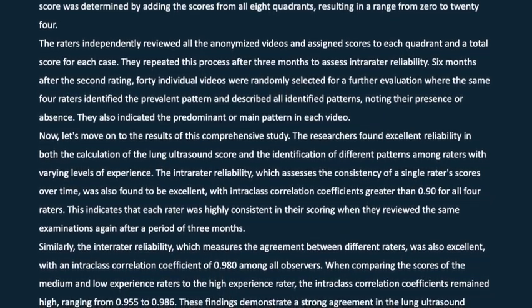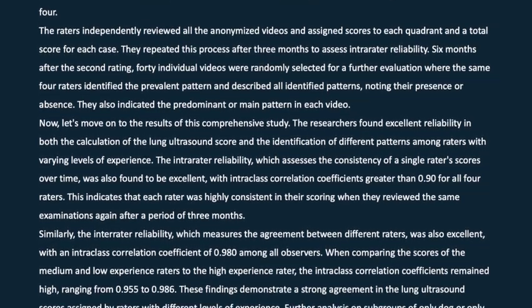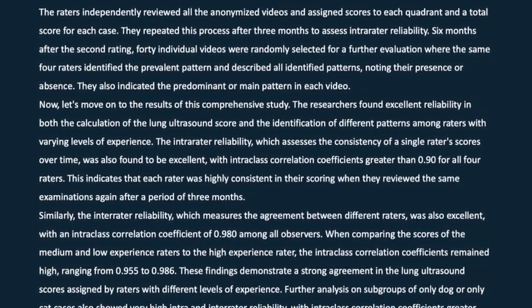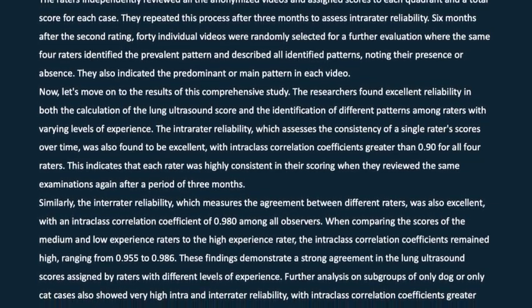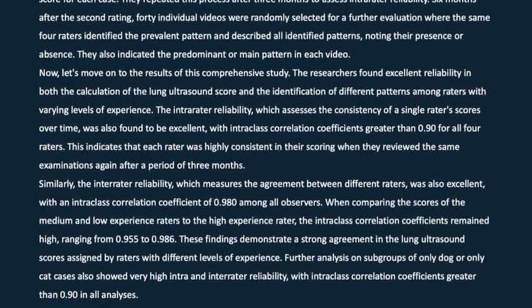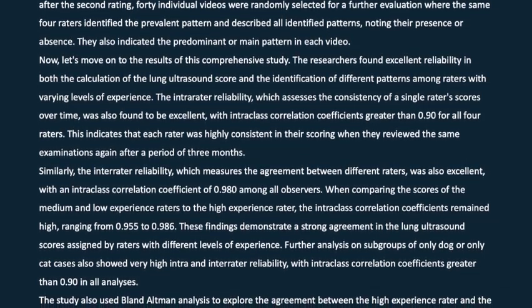Now, let's move on to the results of this comprehensive study. The researchers found excellent reliability in both the calculation of the lung ultrasound score and the identification of different patterns among raters with varying levels of experience. The intra-rater reliability, which assesses the consistency of a single rater's scores over time, was also found to be excellent, with intra-class correlation coefficients greater than 0.90 for all 4 raters.